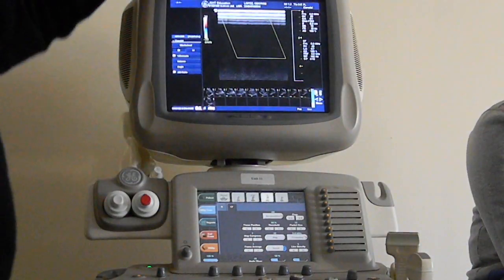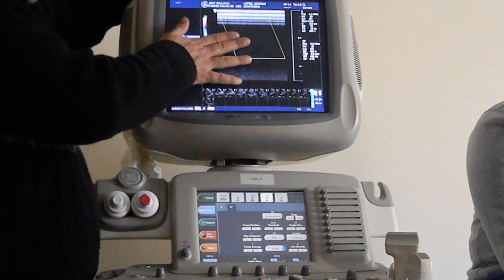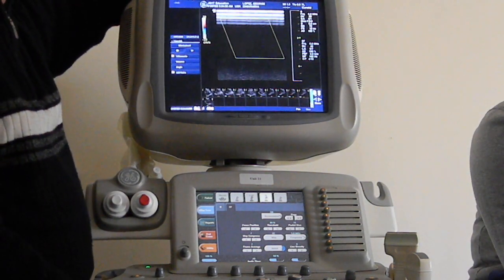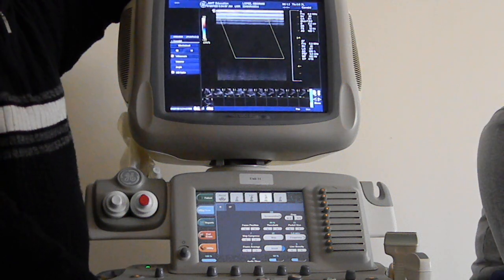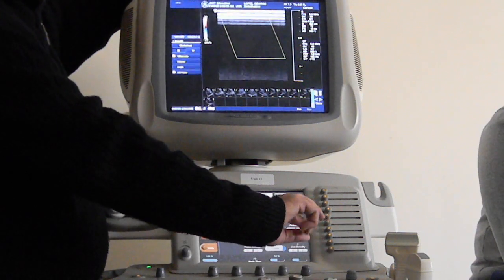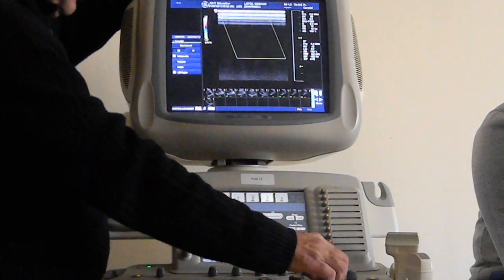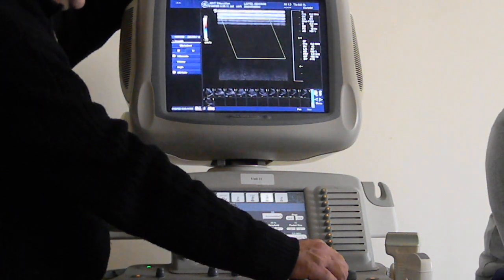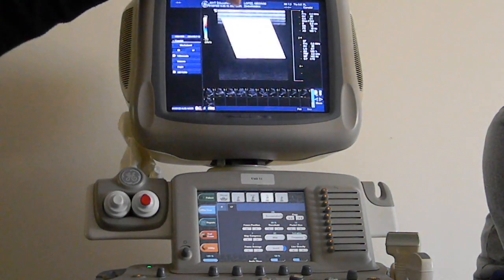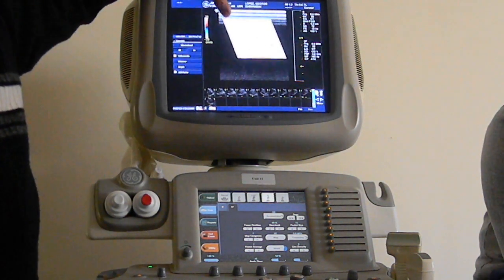Even though right now we don't have any blood vessel, let's say we had one, and we had set the angle correctly, but it still doesn't show any color. Clear? What would that mean? That our color function is probably too less sensitive, so we may increase the sensitivity. Ideally you would like to see something like this. This is good, but too much good is bad.